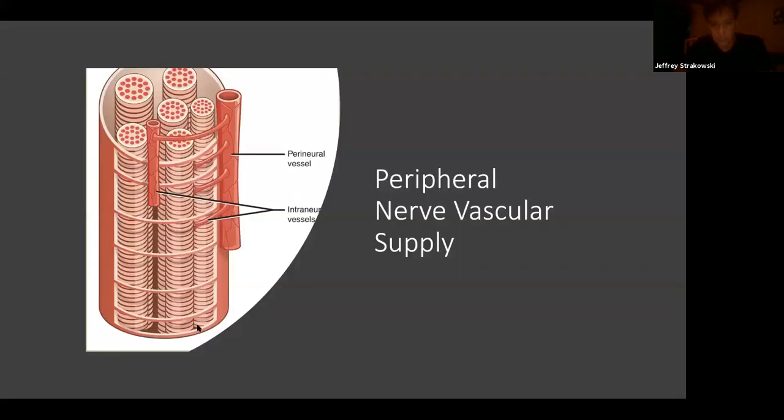Now, with vascular, more and more has been studied on this, and there's still some limitations about using Doppler flow for assessing the health of nerves. Just like tendons develop neovascularization if they're chronically entrapped or chronically damaged, nerves can do the same thing. As a general rule with conventional ultrasound machines, if you see increased vascularity pulsing within the nerve, that's usually an abnormal thing. And some of that will change as we have better direction on what we can do with our gain settings for Doppler and some of those things. But that's just a general rule.